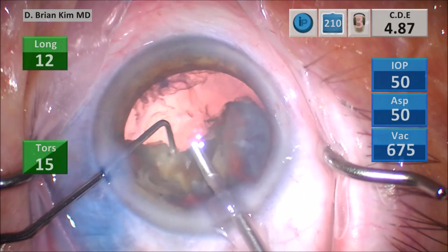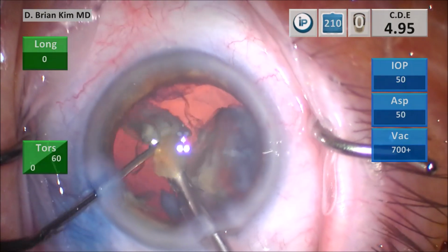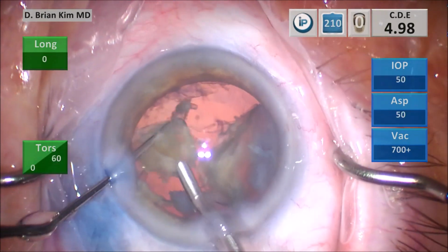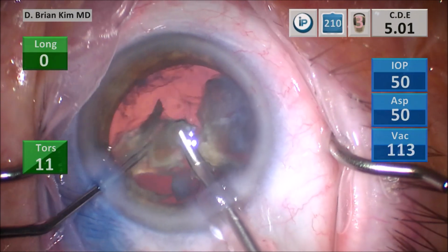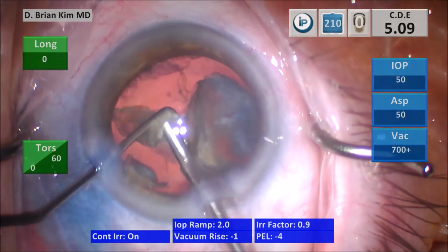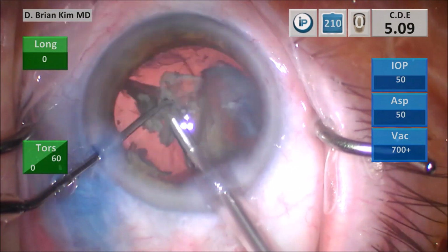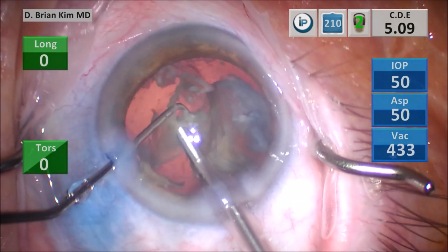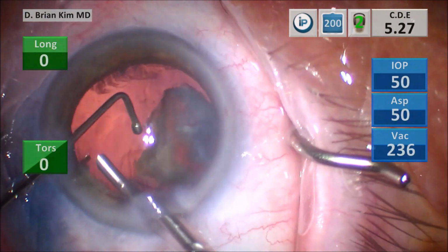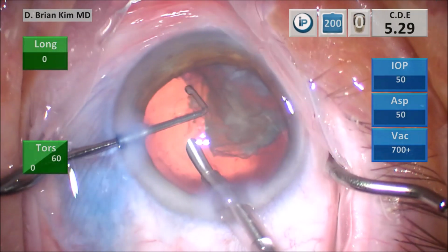So yeah, that's a pretty thick kind of mid-peripheral or paracentral lens material away from that central nugget. But it's really, really dense still. I'm having to use mechanical fracturing forces to really crush and sandwich those lens pieces into smaller pieces. And then, of course, once the pieces are smaller, I emulsify the lens pieces. I always try to protect the bag with those maneuvers. If the posterior capsule is exposed, I use a chopper to protect the bag.